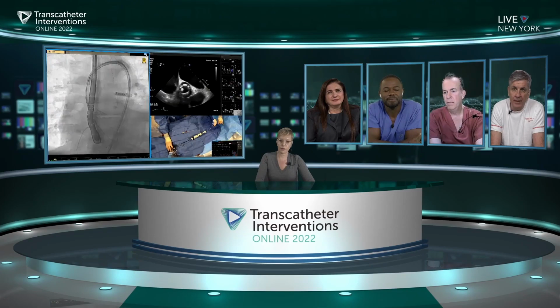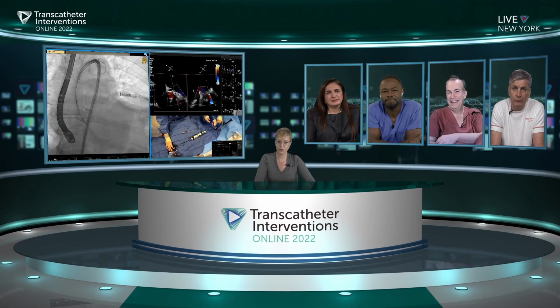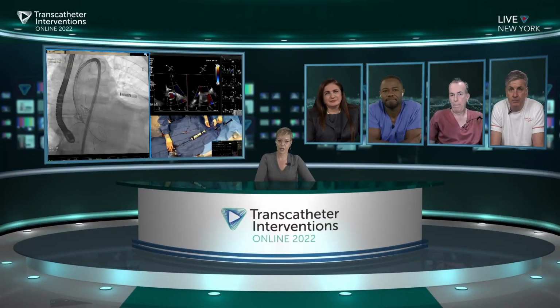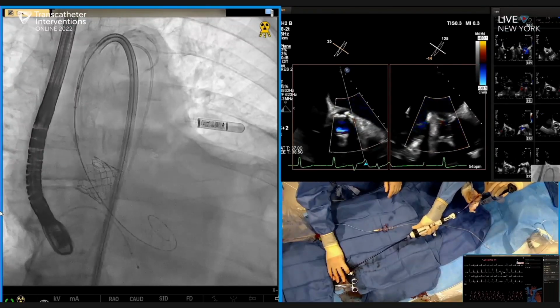Yeah. So what do you think, Becky? Should we post-dilate or not? As I see it, it's a trace to mild PVL in an 86-year-old gentleman who had mild to moderate AR before. I would not push that, to be honest. Yeah, it's really just in that commissure. You think it's mild, Becky? I think it's mild, and I also think it's unlikely that another dilatation is going to open up that commissure.